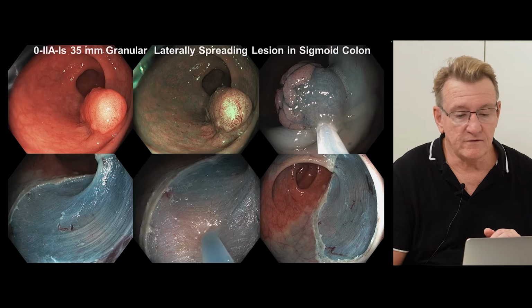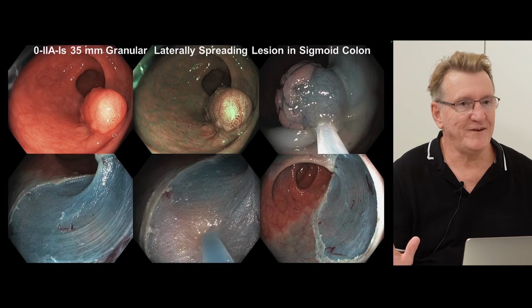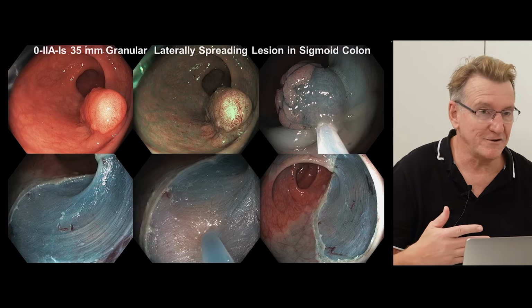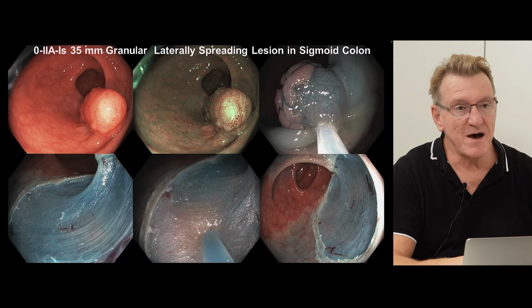If you look at these series of pictures down the bottom, if that patient went out to recovery and had pain, I know 100% that, I mean, there might be another reason that the patient's unwell. Extramural injection, perforation elsewhere, gaseous distension, but this patient is not unwell because of the EMR per se.